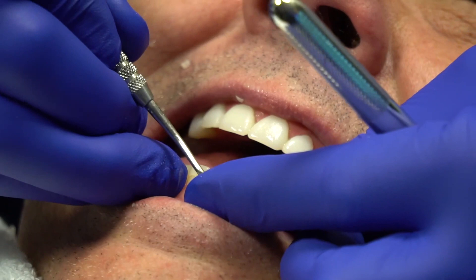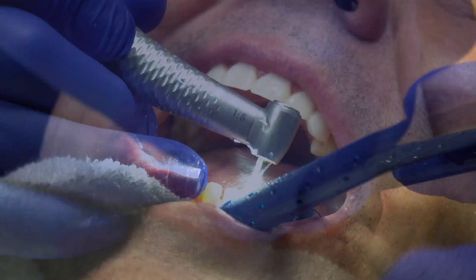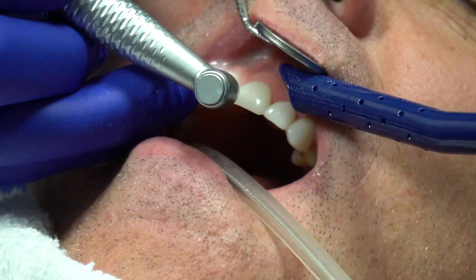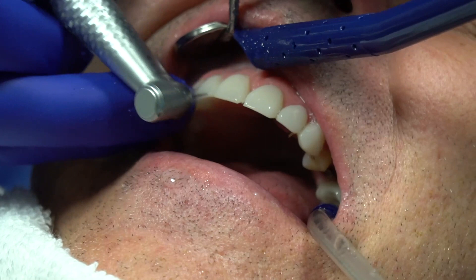I'm going to take a long fine diamond here and go over the surface, removing any of his composite. I'm having to go over the mid-facial of all these teeth where I spot-etched them, making sure there's no composite there. On the upper, these are prepped, so I know I can go in between these teeth and individualize each one really quick through the area. This is the long fine diamond.